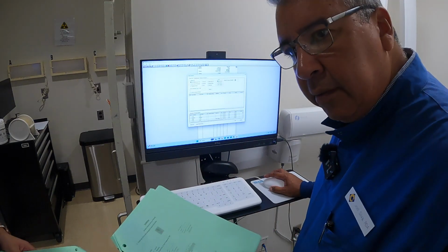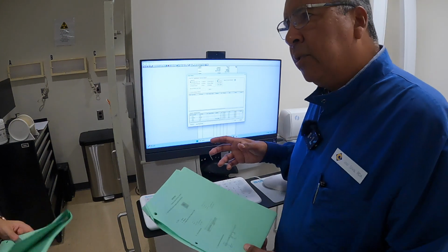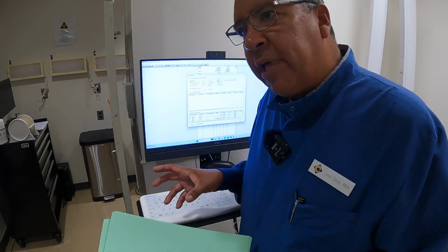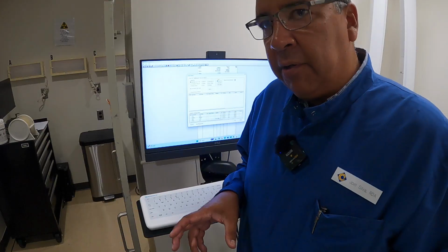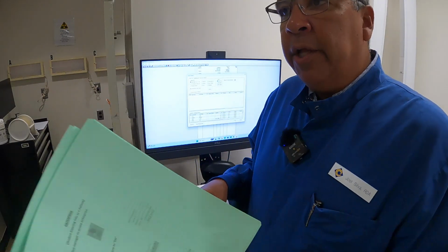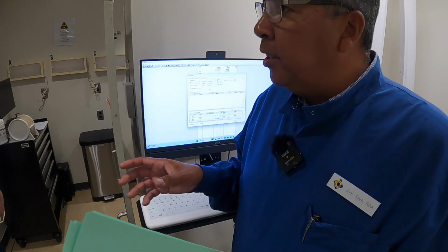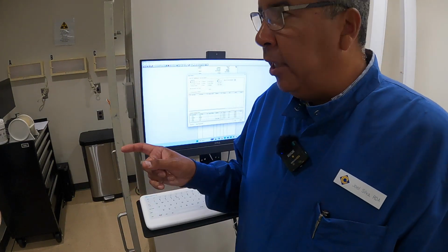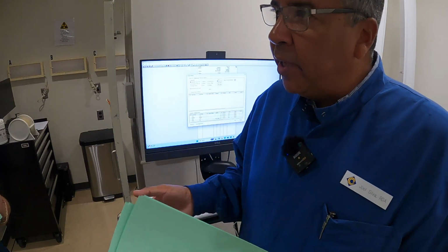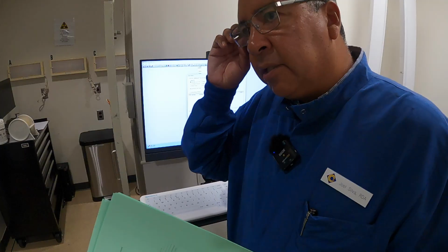Okay, you guys okay now? Okay, so our goal right now is to go ahead and actually make a file for each one of you. And this is the last time you have to actually make one file for yourself, okay? So if you make a file for yourself right now, and you make a file for yourself, and let's just say that you both require x-rays in the course, and you decided that you were going to be each other's patient, you don't have to make another file. It's already in the system, okay?